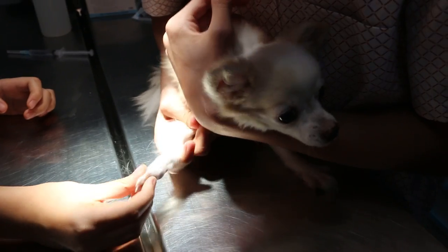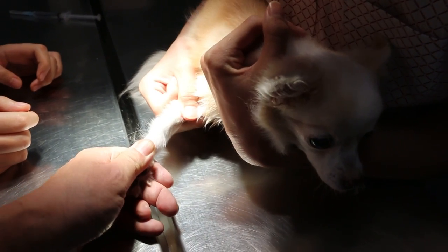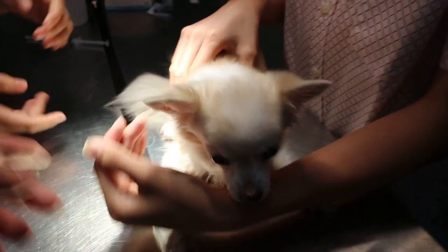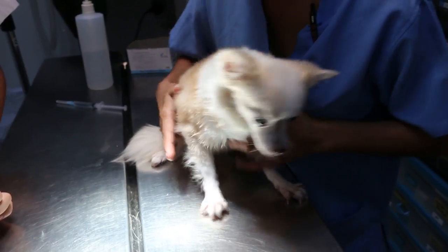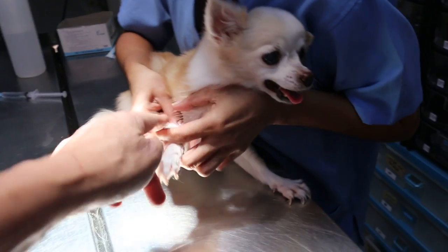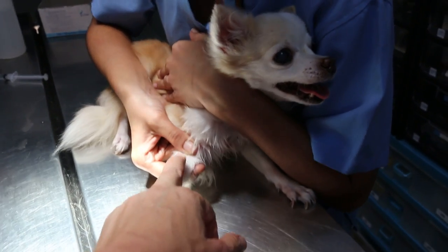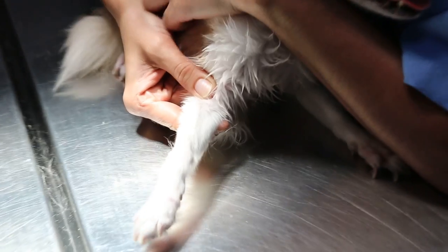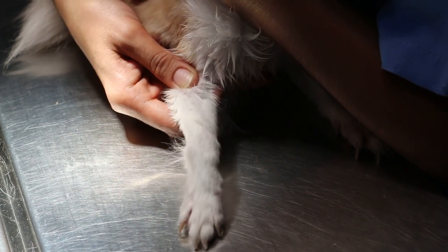You need to use the middle finger — pull the leg at the back of the elbow, then press. This is to restrain her from pulling. Okay, let her do it first, because this small dog is harder. See one more time. See how she does. Back of the elbow, middle finger. This one touches the body. The thumb is pressed, the forefinger is under the leg. Thumb to occlude the vein, so that the vein comes out. My middle finger is at the back of the elbow so that she cannot pull her elbow back — you have the control. You can see the vein coming out. So if you don't use your middle finger, you control the back side.